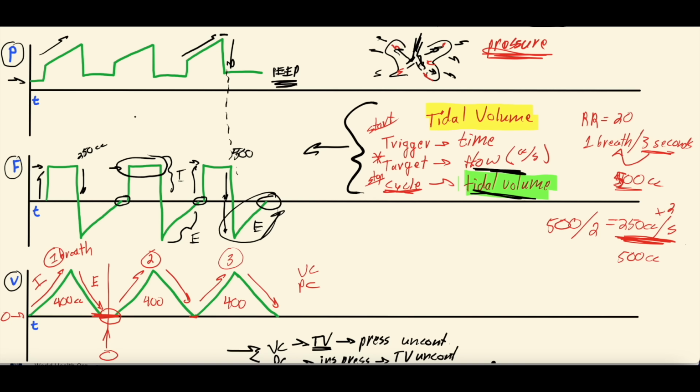And as you'll see, and we're going to link all these in the video description, when we talk about pressure control scalars, this looks different than a pressure control scalar. This ramp up is characteristic of volume control because you have a set flow rate, and as that flows over a period of time, let's just again make it up, say it's 2 seconds, for every 1 second it's kind of pushing in 250 cc's per second, or you could break this down even further into milliseconds, but it's flowing a certain volume of air in per millisecond, and that is slowly filling up the lungs, increasing the pressure until that breath is over, at which point the patient expires and the pressure goes back to the end expiratory pressure that we set on the ventilator.